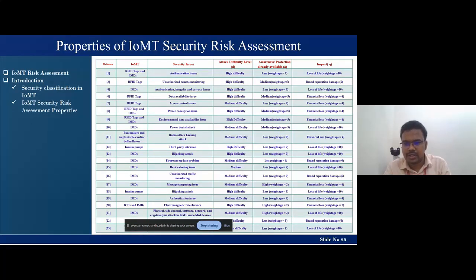How to prevent it is the second category. Protection and the reactive mechanism are the important area here. Awareness is nothing but, once a particular incident has happened, they need to respond to that attack in a wise, clever way. If they are very much aware of the system, the weightage level will be something between 1 to 10. Based on high and low levels, different values have been assigned for the particular attack on the particular device.